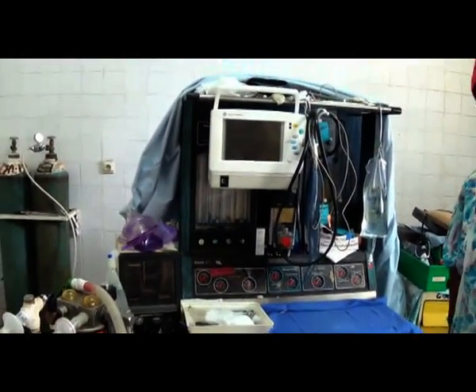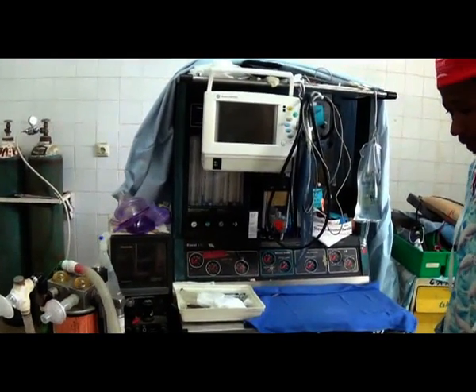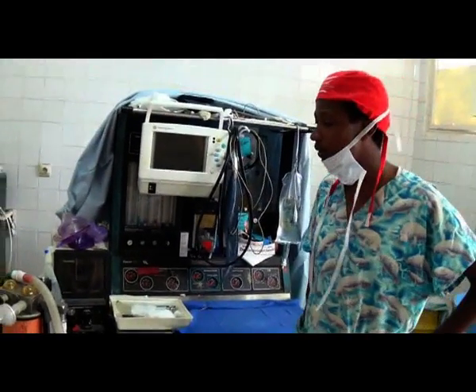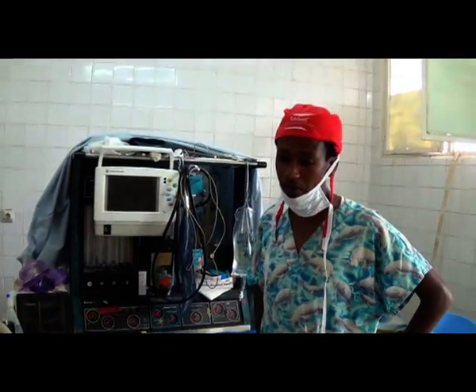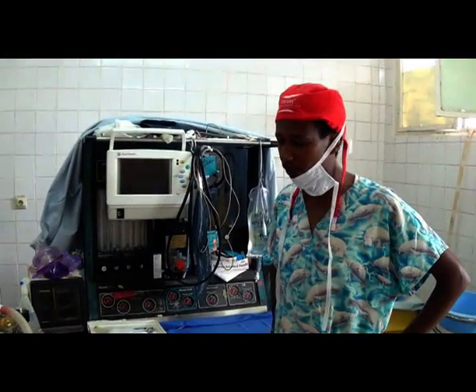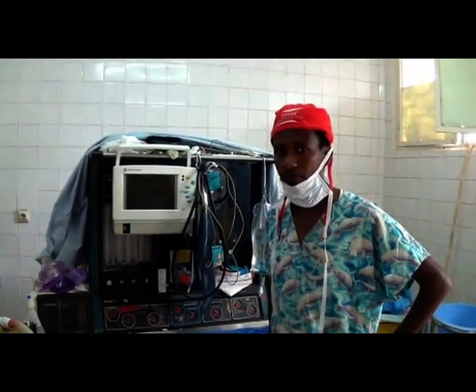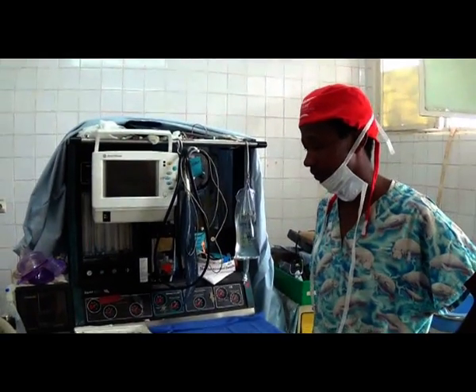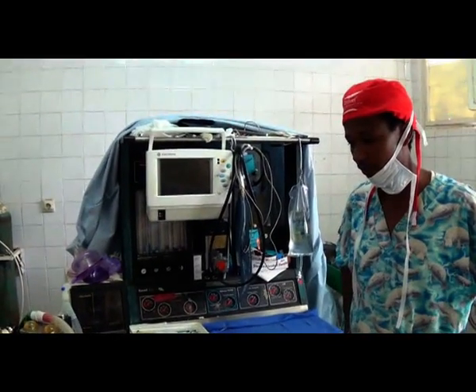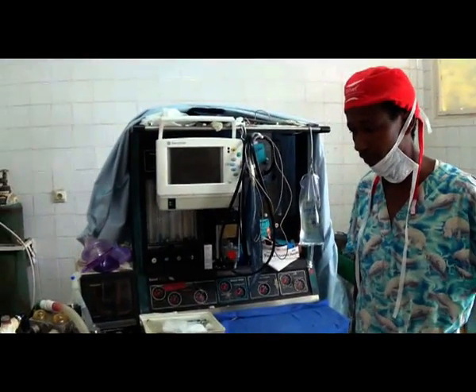And for how long has the machine been having these problems? I'm not sure. When I came here, there was one anesthetist before me. He showed me everything about this machine. Maybe before him, he had served here for 4 years as an anesthetist. I don't know the accurate years since it was not functional. I thought it may be more than 3 years. Okay, 3 years. So for the last 3 years, you have been using this problematic anesthesia machine, which is a great frustration for the recovery of the patient under operation.